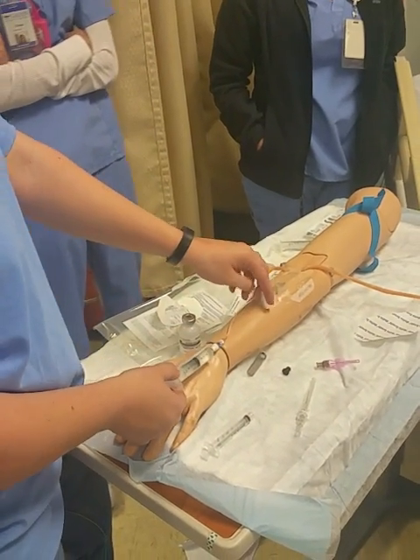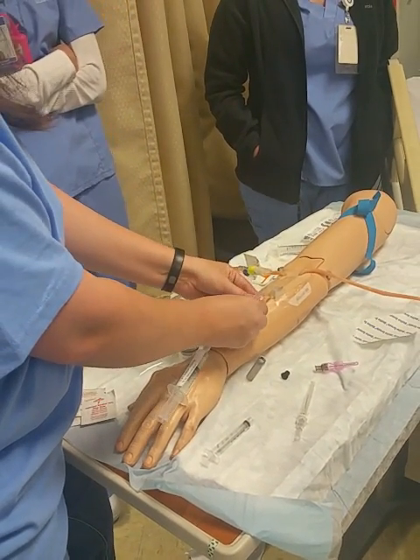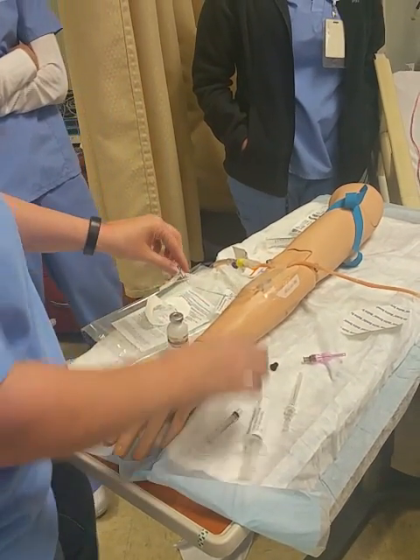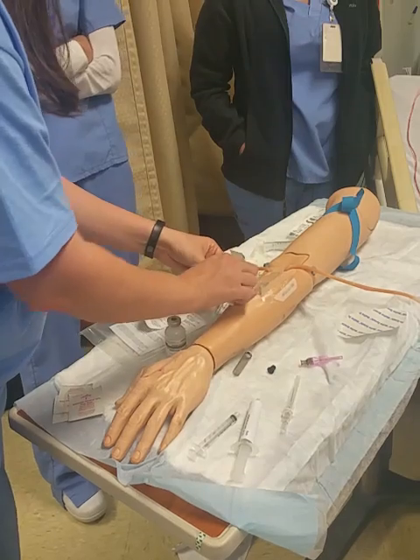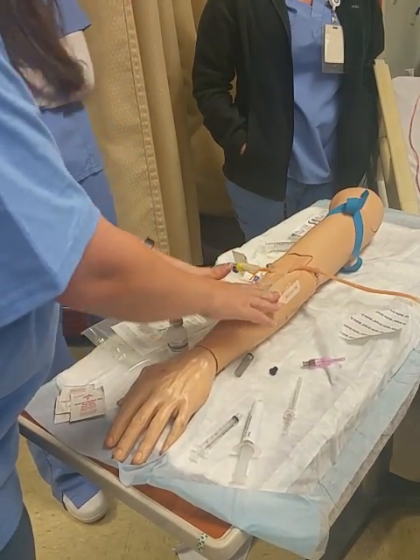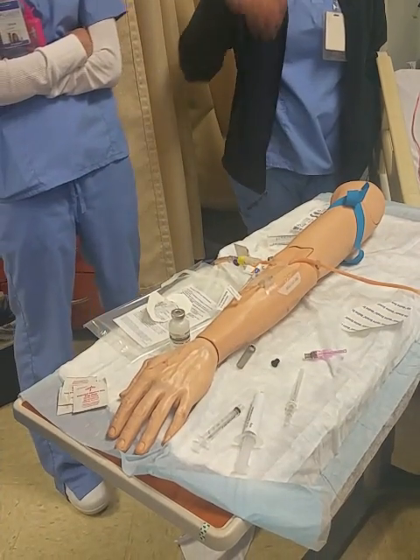So before I take my syringe off, I'm going to close the clamp so that I don't get the blood flowing backwards. I'm going to disconnect, retape my tubing, give my patient their medication instructions. You know, I just gave you Lasix. It's going to make you have to go to the bathroom.